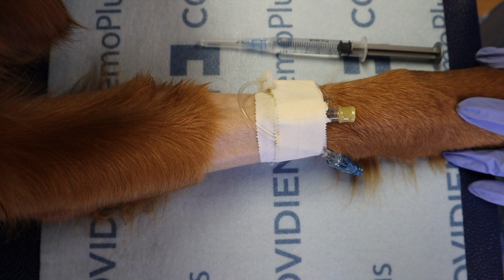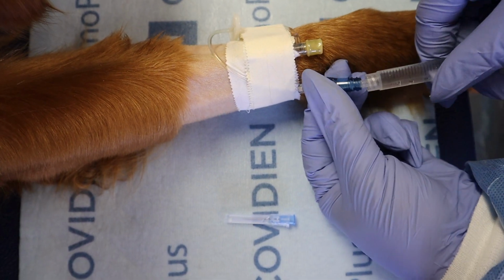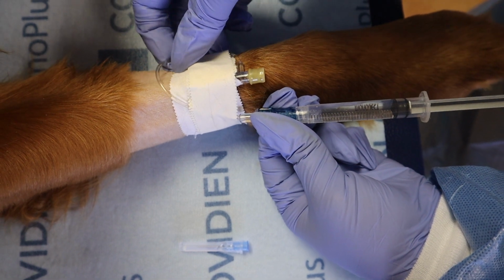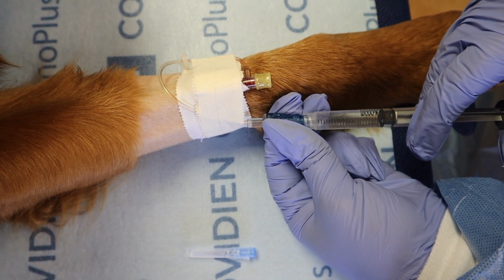If the IV catheter was not placed immediately prior to chemotherapy administration, then we recommend that placement be confirmed one more time. The IV catheter must bleed back with ease. If the catheter is occluded or vein is blown, replace it with a new catheter into a different leg. Flush your catheter by attaching your saline flush to the T-connector's blue clave. Pull back on the plunger of the syringe until blood is noted in the line, confirming proper placement of the IV catheter. Then flush the line completely and clamp the line.